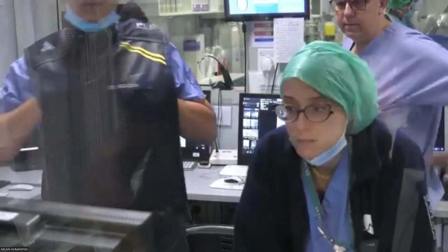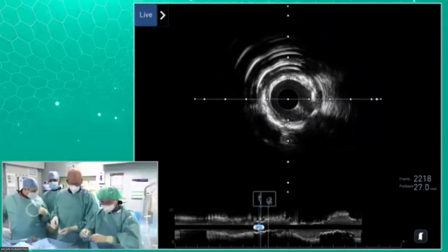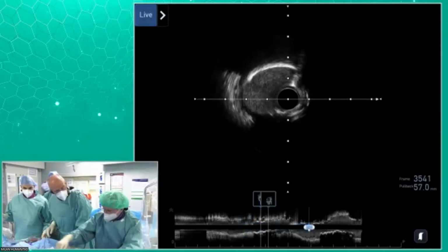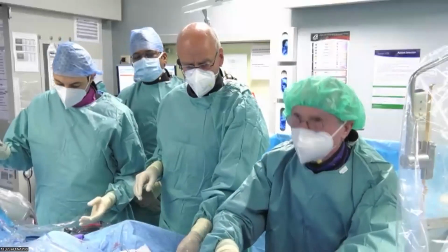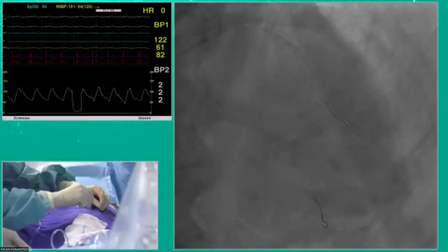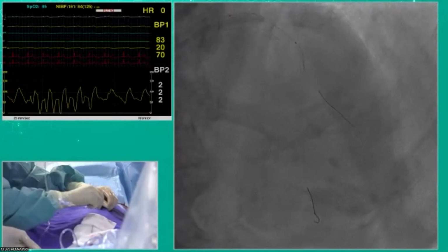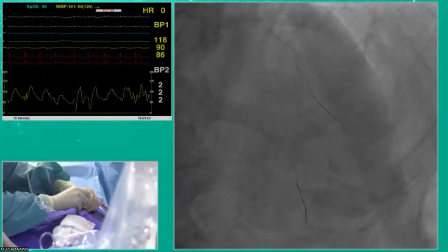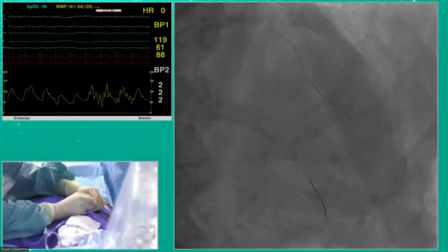Yeah, but I think proximal LAD in Italy or in Europe in general is 3.5. And it's a big gentleman. Okay, so we go with the 2.5, 40 Magic Touch. We try to go down quickly, not spend much time in the guiding catheter, which is an XB4, so it's a large gentleman. Okay. Let's get a little bit of support. The delivery is kind of nice.